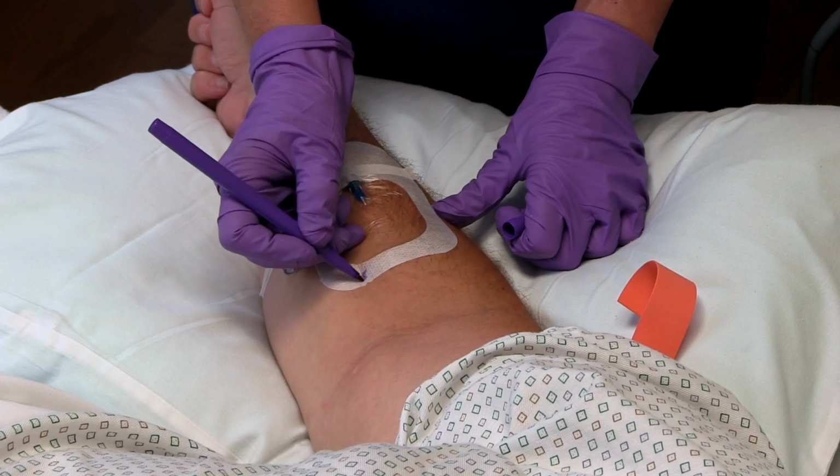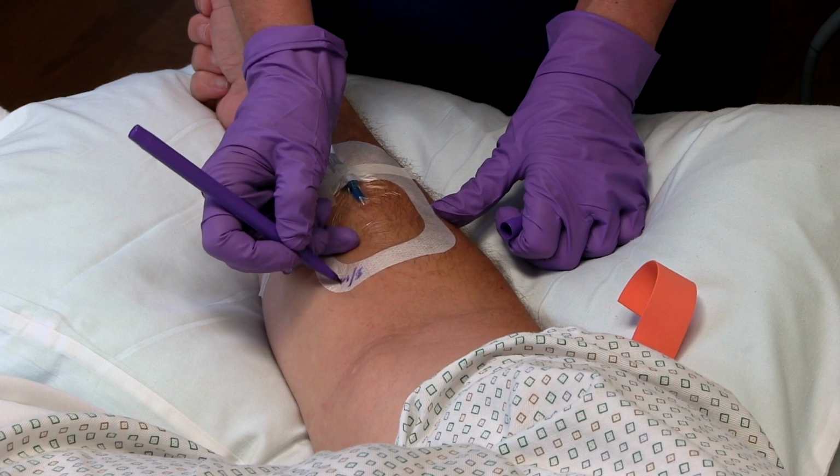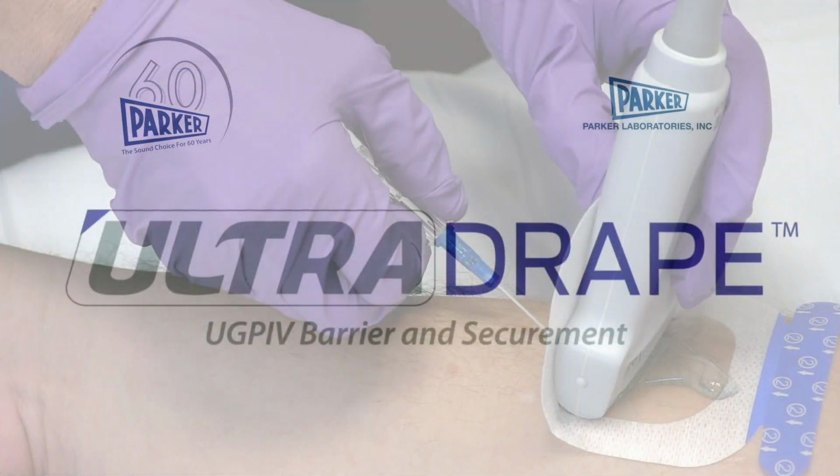You have now completed the insertion procedure using the Ultradrape, sterile barrier, and securement for ultrasound-guided peripheral intravenous catheter placement.